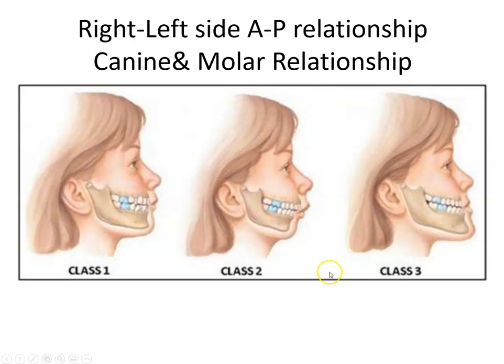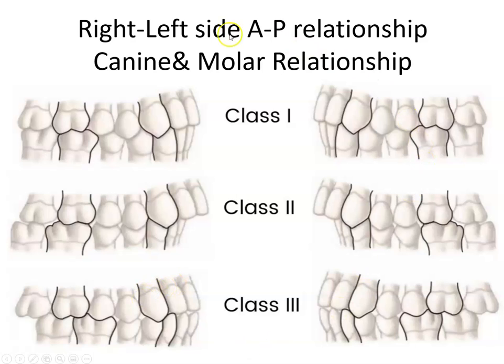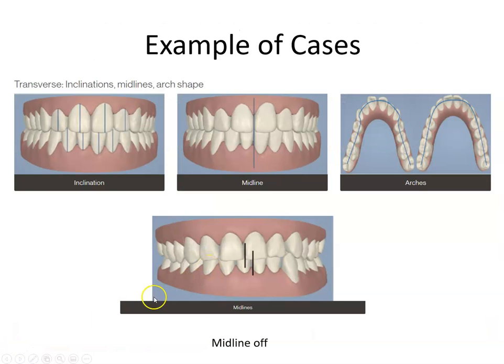We always want to create an ideal position, but that ideal position isn't just going to class 1, it's what the patient's jaw and bite allows to do, and where we're having both function and aesthetics in perfect harmony. The teeth have to function well. Now we're moving forward for example cases.